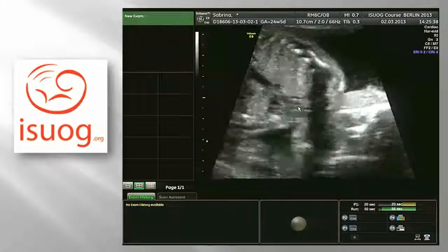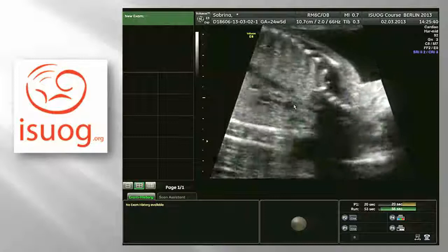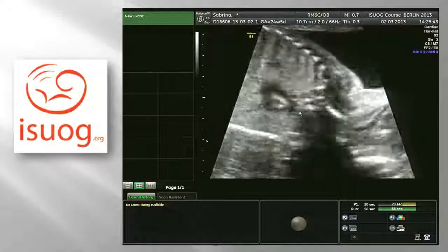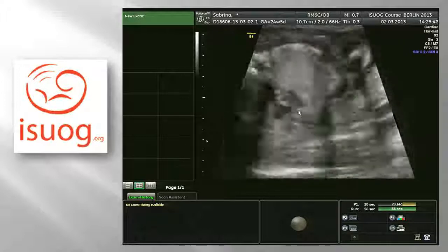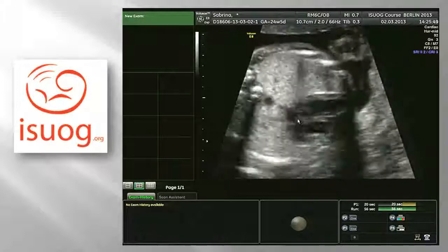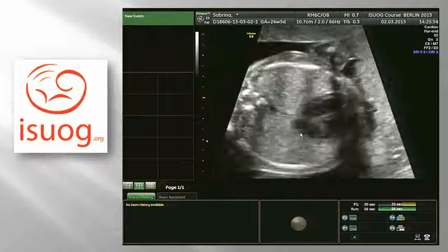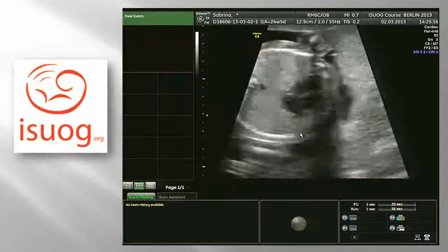It's a problem of the bones, because I search for the trachea, and in cases with double aortic arch, we always have compression of the trachea, and this is one of the leading signs for double aortic arch, but it's not really good to present. Try with color now, please.